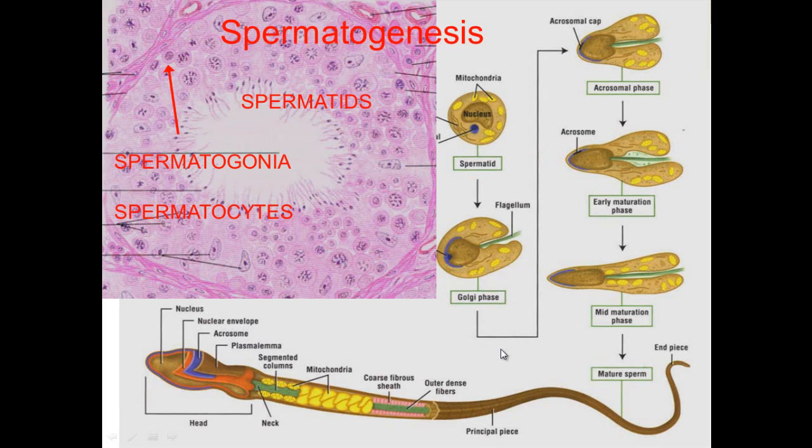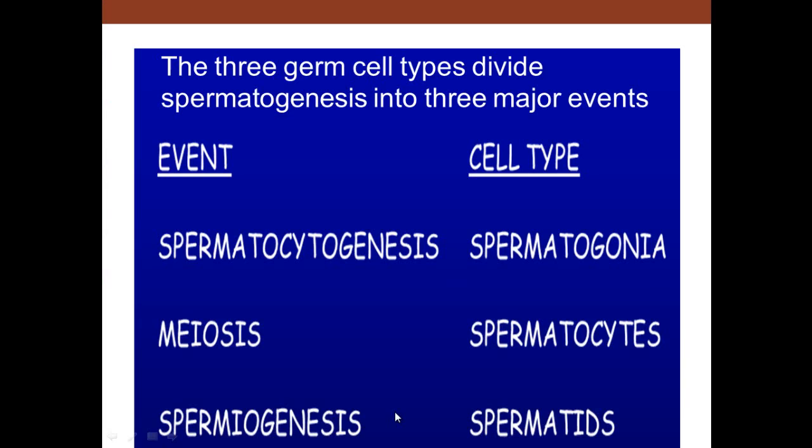And here we can see again late spermatids, Sertoli cells, the myoid cells, primary spermatocytes, and Leydig cells. So we have the spermatogonia located on the base. We have the spermatocytes, which are the biggest ones, and then we have the spermatids. And here we see two generations of spermatids, a younger group and an older group. They start out with a round cell with a round nucleus, and then you get development of the acrosome. It forms a little cap, and then ultimately the tail has developed.